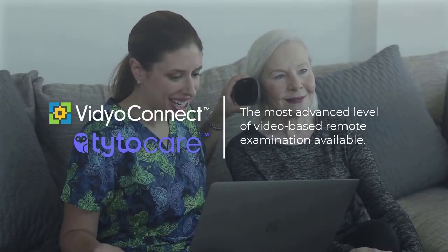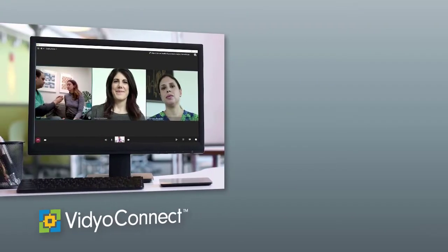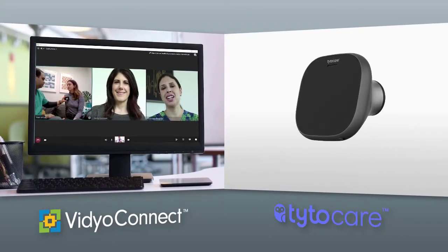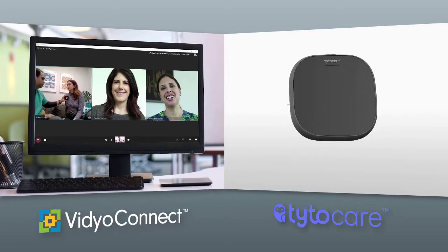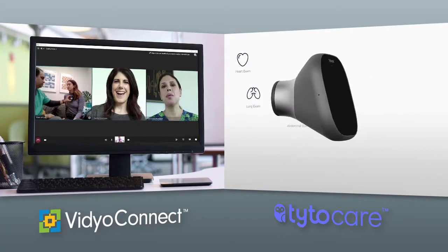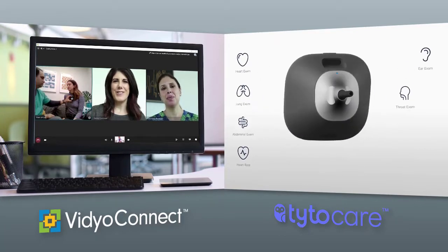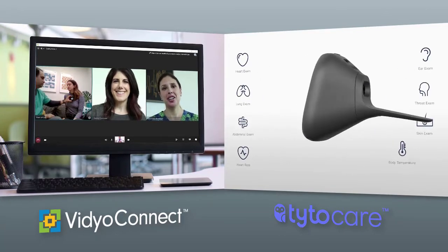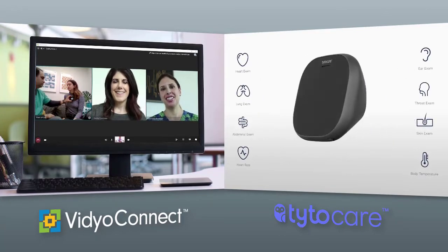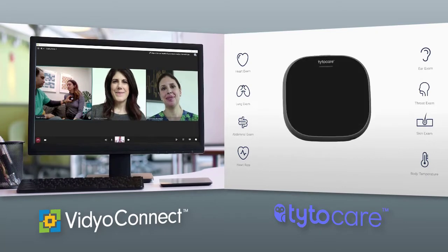The integration allows clinicians to remotely see and speak with patients and providers using Vidyo's proven platform while operating Tytocare's all-in-one stethoscope, otoscope, thermometer, and general exam camera to perform physical exams remotely.